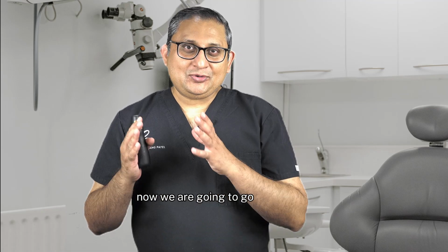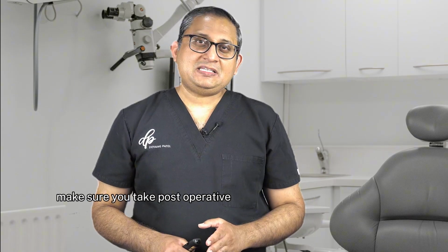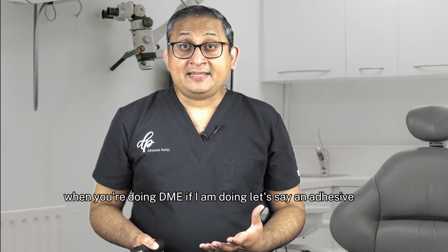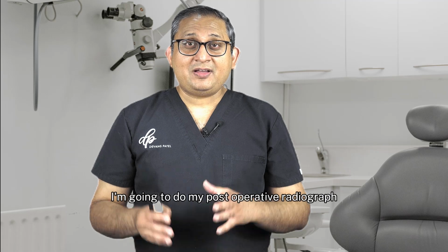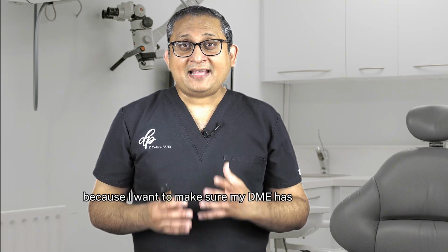Now we are going to go to tip number 3, which is again a crucial, important tip when you are doing deep margin elevation, which is post-op radiograph. Make sure you take a post-operative radiograph of every single case when you're doing DME. If I am doing, let's say, an adhesive onlay, I'm going to take my post-operative radiograph before I do preparation for my onlay, because I want to make sure my DME has been done properly.